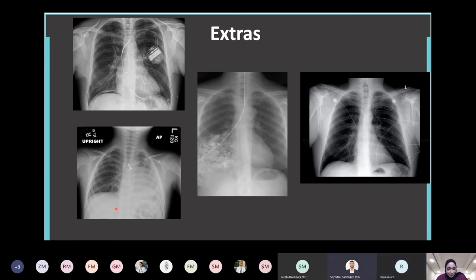Just one question. So after a surgery or laparoscopic procedure, if there's air still inside the peritoneum, should we be worried about it or no? A small amount, I wouldn't be worried about it. But it depends what kind of procedure. If it was a laparoscopic procedure, that means we went into the peritoneum and we put carbon dioxide inside, because we wanted to inflate the peritoneum to be able to work. But let's say this patient did not have laparoscopy and had, for example, a colonoscopy. Then we will be worried about perforation.